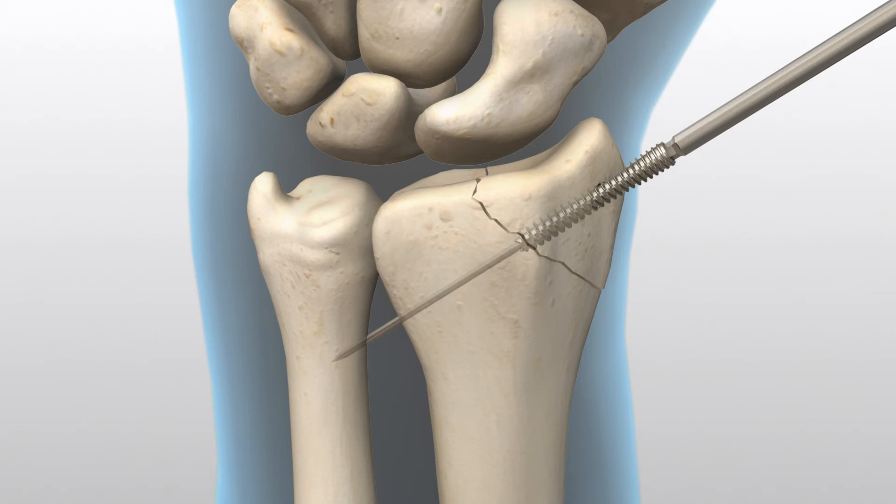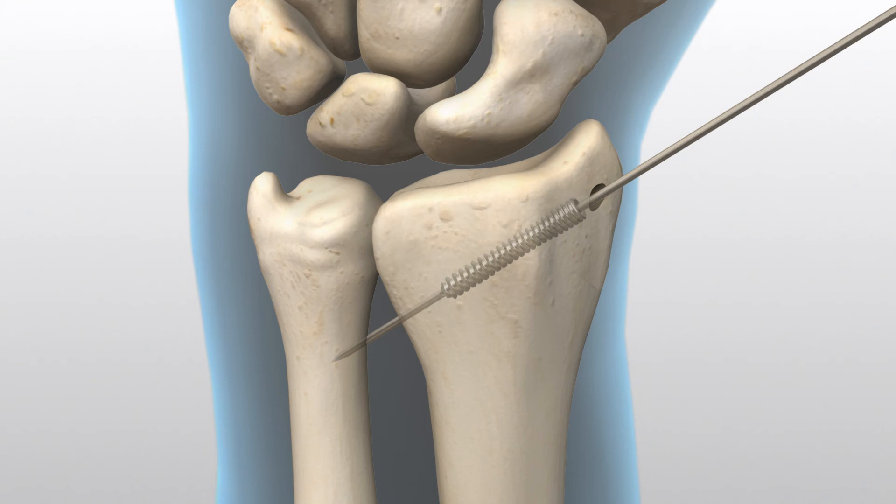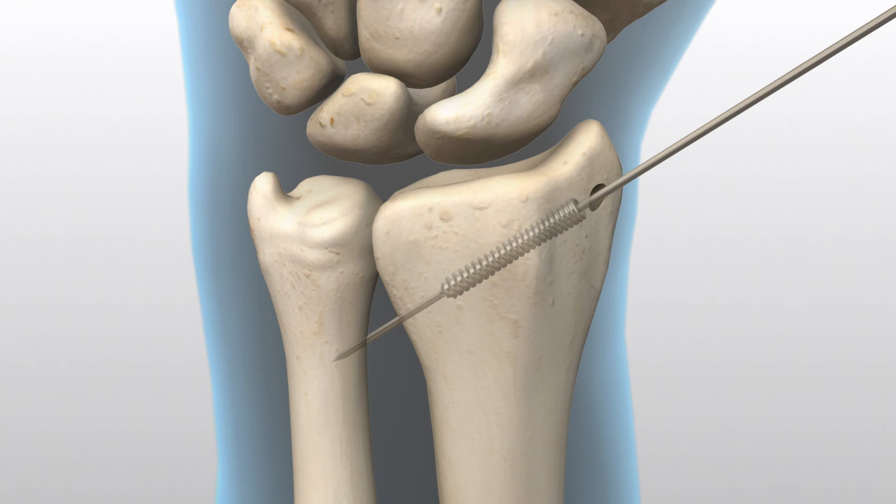Insert a screw that is the same size as determined by the percutaneous screw sizer with the 2.5-millimeter hex driver. If resistance is met upon insertion or distraction occurs, stop, remove the screw, drill with a long drill, and reinsert the screw. Dense bone may require using the long drill and possibly downsizing screw length.